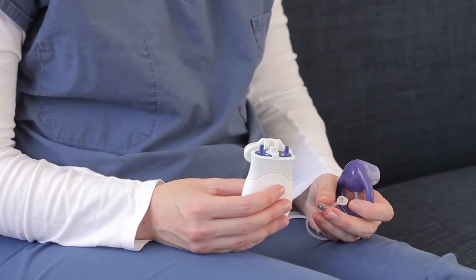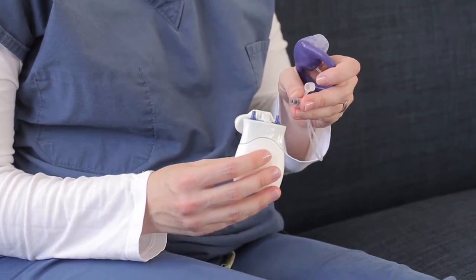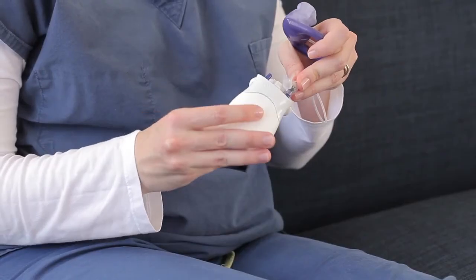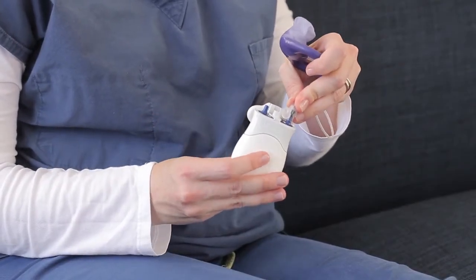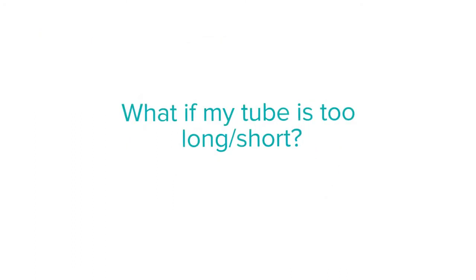If you're having trouble inflating the insert, first make sure that the plus port is connected to the valve and that the internal black part of the valve is pressed all the way down onto the pump. If the length of the tube is bothering you, simply contact your healthcare provider who can help you shorten or lengthen the tube.